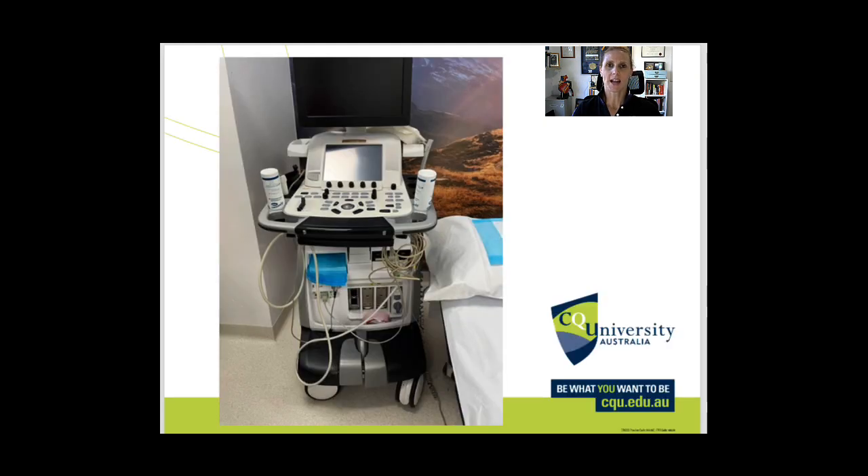Here's an image of a typical cardiac ultrasound machine. As you can see there are lots of cables and gel bottles and things that can come off and cause potential hazards. So we want to be aware of each part of the machine and how we clean it.